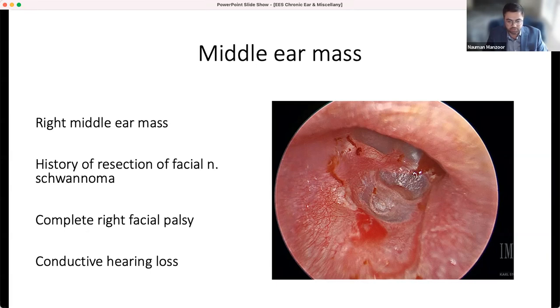The other question, I was just looking at it, so two things. I use a sickle knife, and once you go underneath, once you elevate that cap, you're in the right plane. And then the direction of the dissection should be in the long axis of the malleus, so you're minimizing any anterior-posterior force on the malleus.